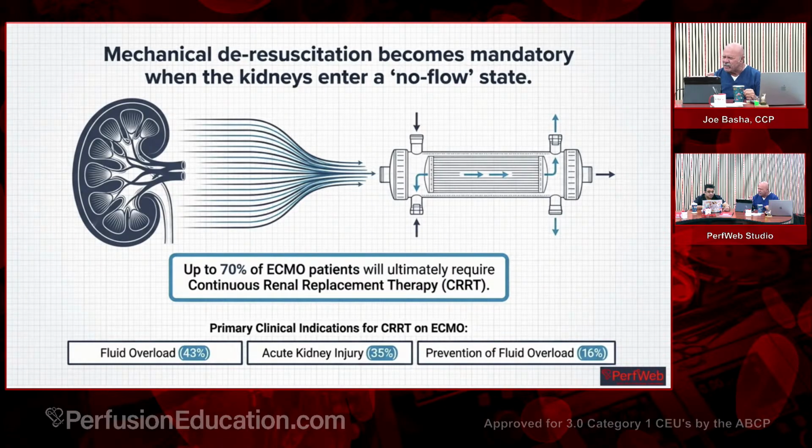The problem is that when you don't have a pump controlling the fluid coming out, you can forget to clamp it or not clamp it well enough. Your fluid balance is constantly varying too dramatically. It's not as controlled as you want it to be. Right.